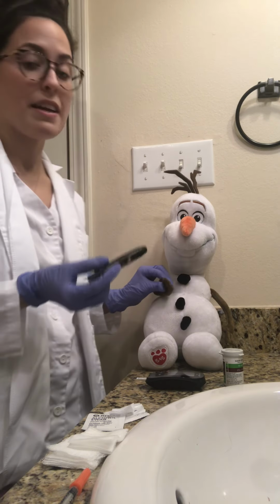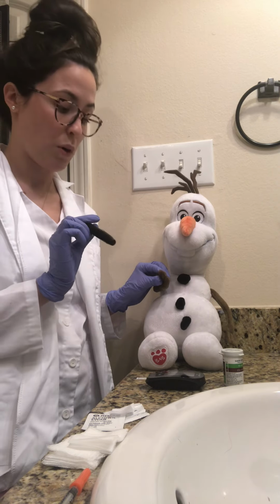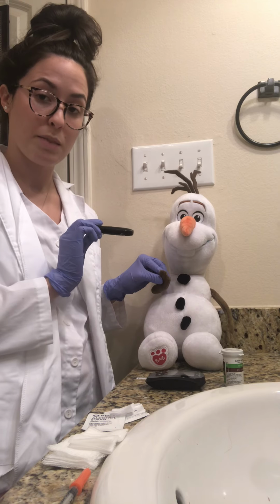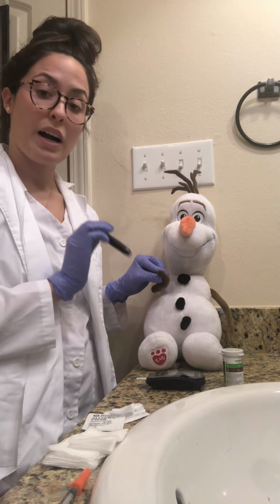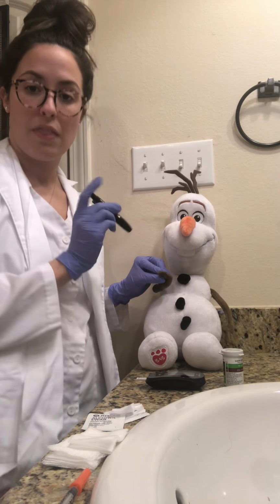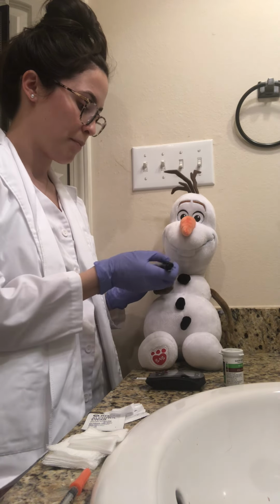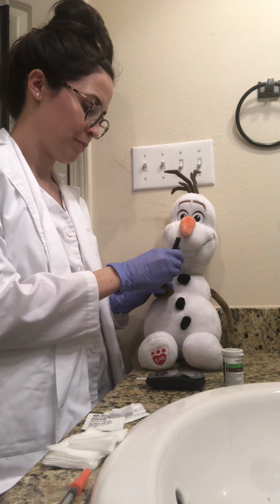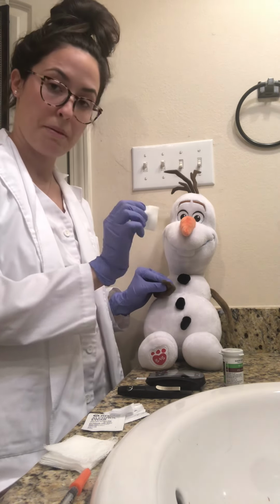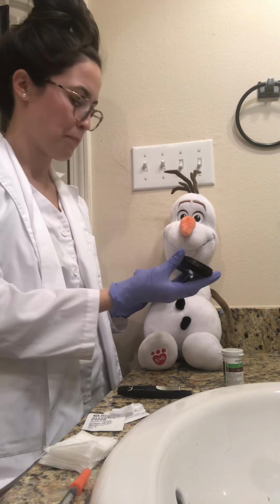All right. Being that I do not want to contaminate the part of the finger that I wiped with the alcohol swab, I'm going to squeeze the finger just proximal to that area so I push all the blood towards the tip, and it'll be easier to obtain the blood measurement once I stick him. All right, Mr. Olaf, big stick, okay? Great, and so we're going to get a piece of gauze and wipe off the first drop of blood, so we have a clean drop that's not contaminated by the alcohol or anything like that.